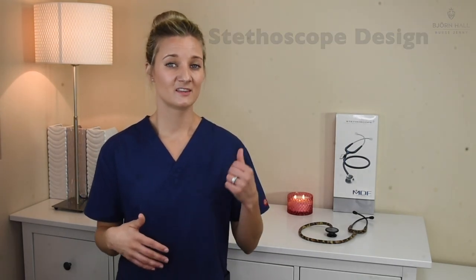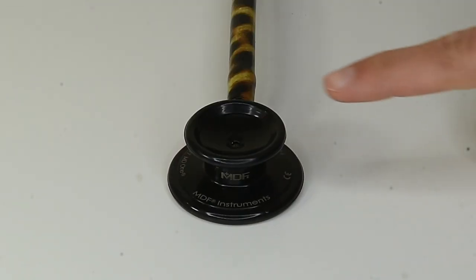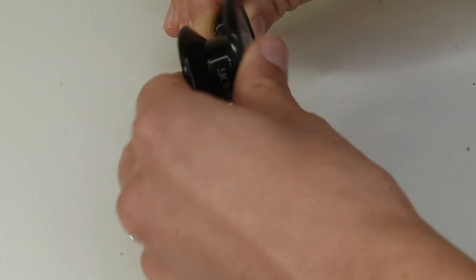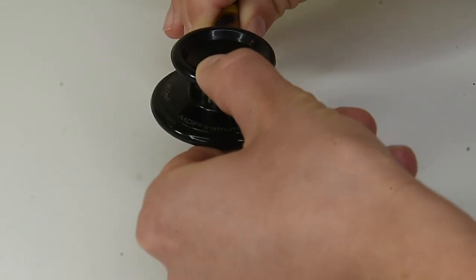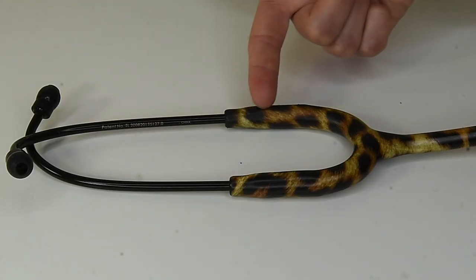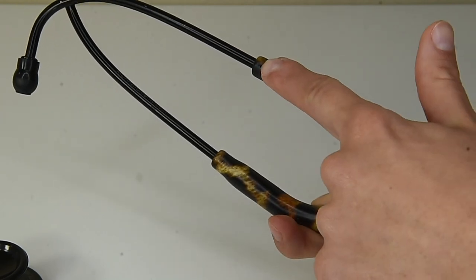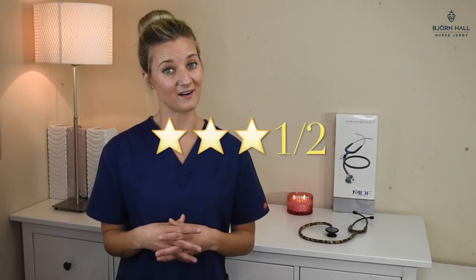Stethoscope design. The chest piece is quite nice — I like the design of it. The bell side does not convert to a pediatric side, so you don't get that in the spare kit. The chest piece is turnable, which is really good, and it's black, which looks really nice with the print. The binaurals are also black, which looks really cool. I would have given it five out of five if not for some pieces of the print missing and the bubbles, so I've given it three and a half out of five.